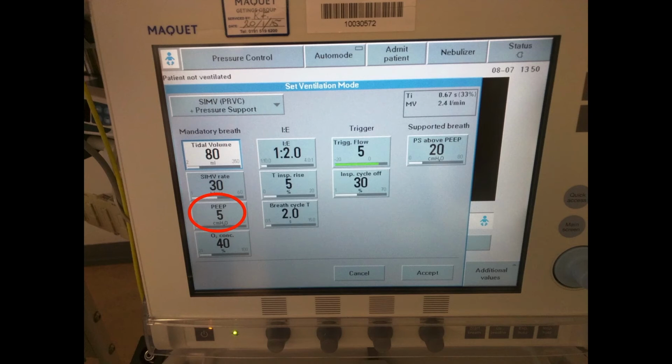You shouldn't be using a low PEEP and having lots of the lungs collapsed just because you're scared to turn it up. Likewise, if you've got normal lungs and you give the patient too much PEEP and overdistend them, then yes, you will have a risk of causing pneumothorax, and that would be wrong. So you need to use the right amount of PEEP that's right for your patient and not be worried about the problems with using excessive PEEP.